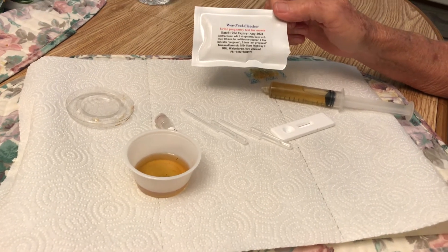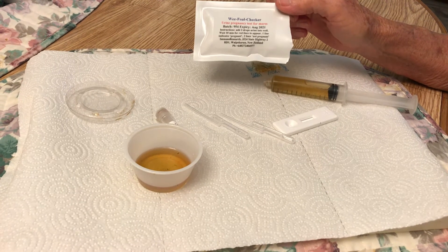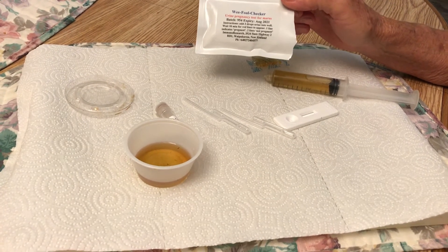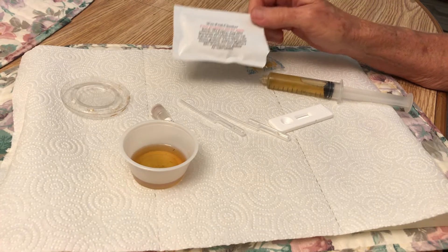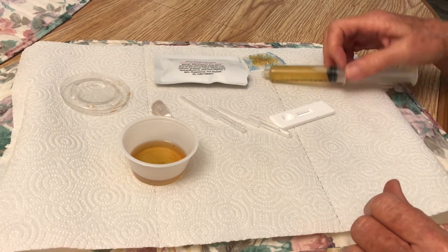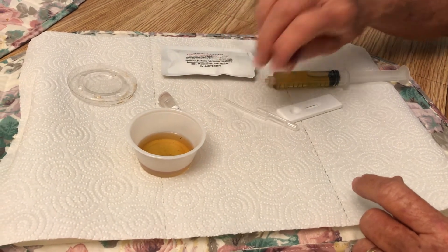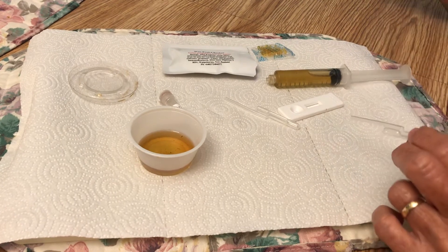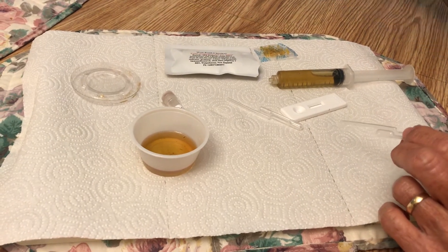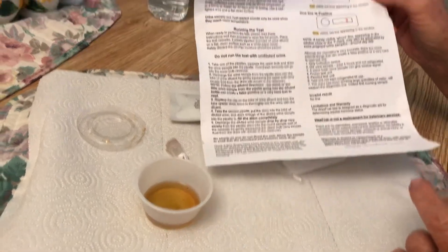I'm going to show you how I'm doing the WeFoal pregnancy checker test. We've got a mare that had her bred, but we're not sure if she's pregnant or not, so we want to find out. I took a urine sample, which was not easy to do — we might make a video of that sometime to show you how to get the urine from the mare. I'm using the WeFoal 120 urine test.